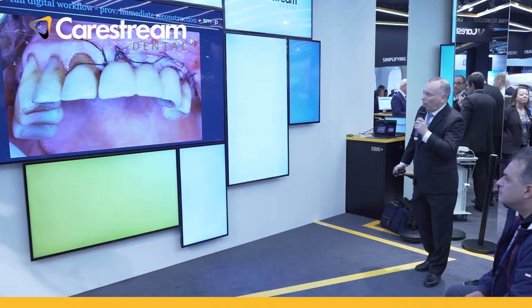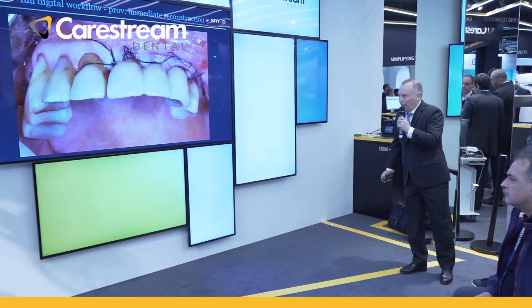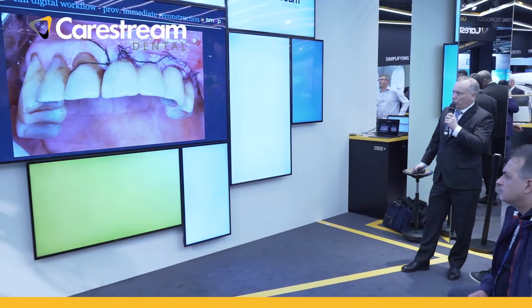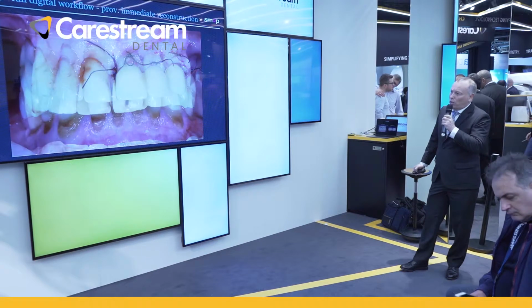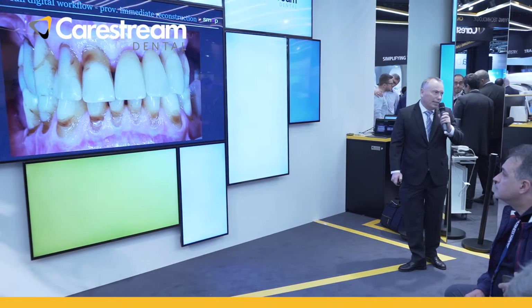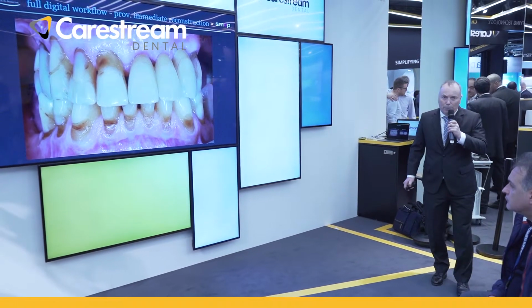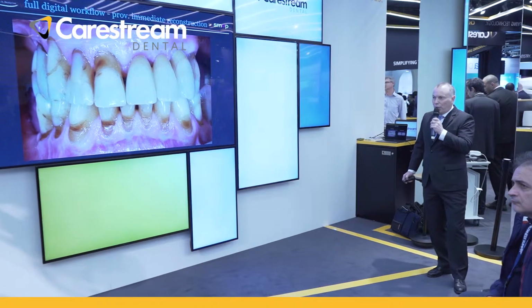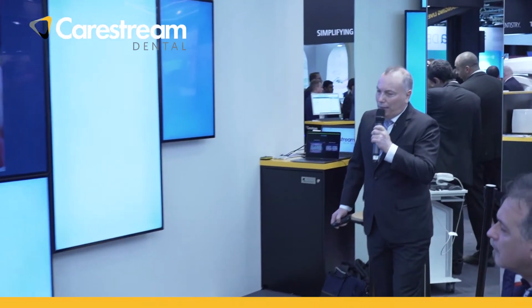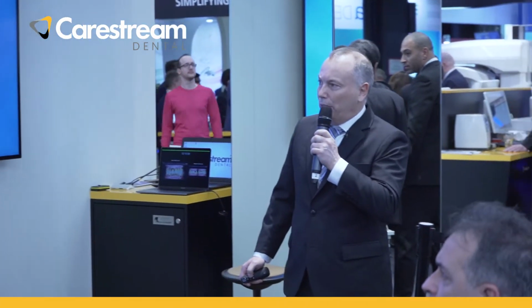So 1 hour after I started, the patient could leave my office with a provisional bridge. Because this patient was referred by a dentist, and most of my referring dentists do the final work themselves, 3 months after the placement of the implants the referring dentist made this ceramic bridge, also in a digital way.